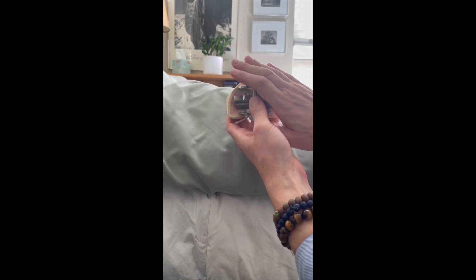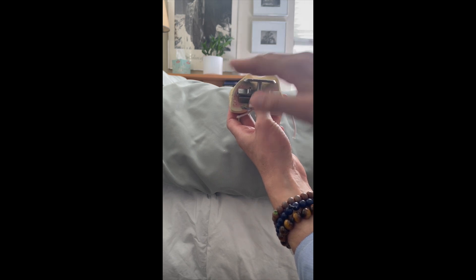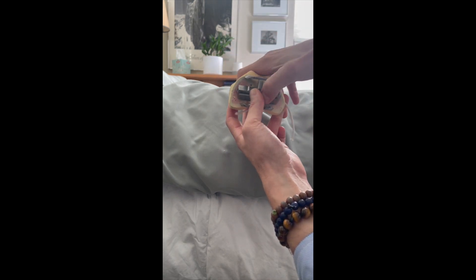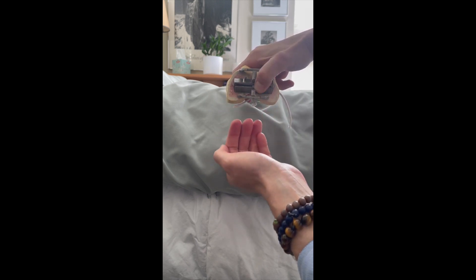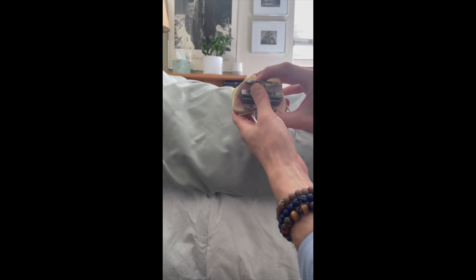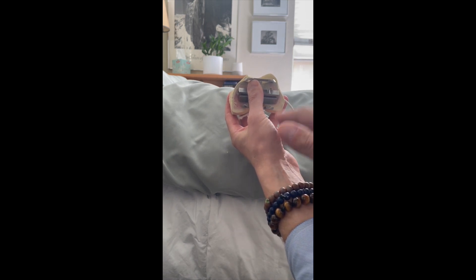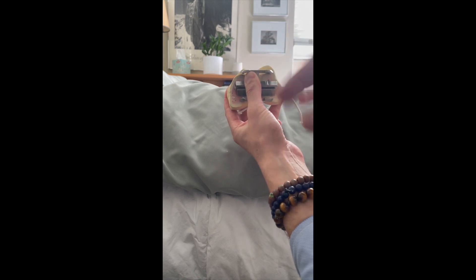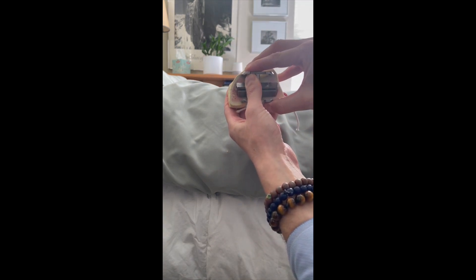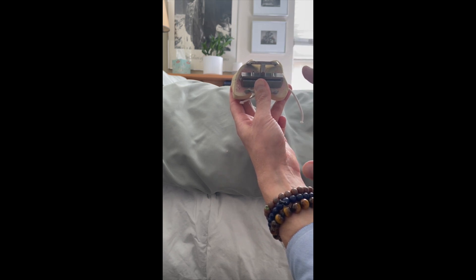The more important thing is: when you put this on, do not think of it simply as just a four-in-one cutting guide. This is an additional way to check before you do anything — am I going to notch? Do I like my sizing? Based on the patient, do I have enough bone? Am I taking too much or too little before I make my cut? Do I need to adjust my rotation? Especially for valgus knees, more people have a tendency to overly externally rotate — you don't take a lot of bone laterally, you take excessive bone medially, and then you have to release the lateral side aggressively to compensate. By doing a little gap balancing or looking for anatomic landmarks with a conventional four-in-one cutting guide, you're more likely to end up with a balanced knee without excessive releases.